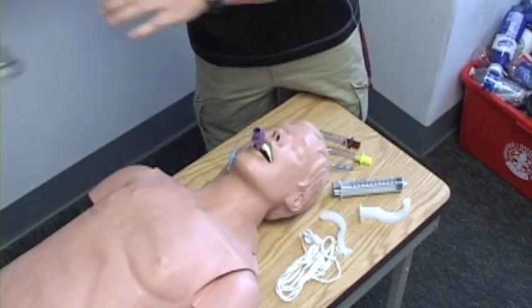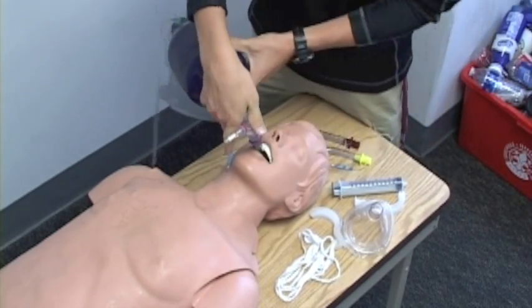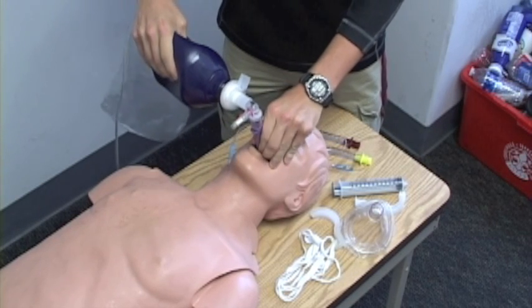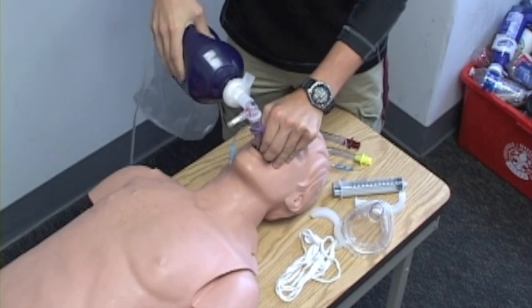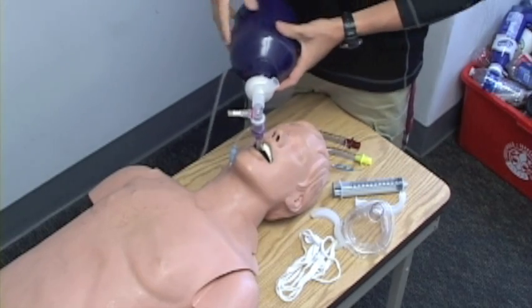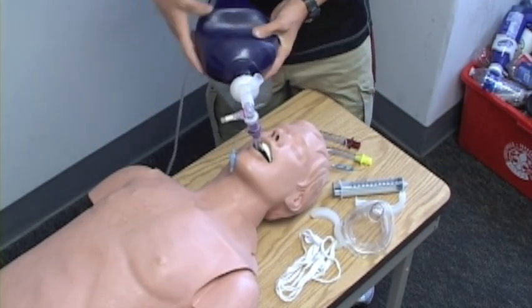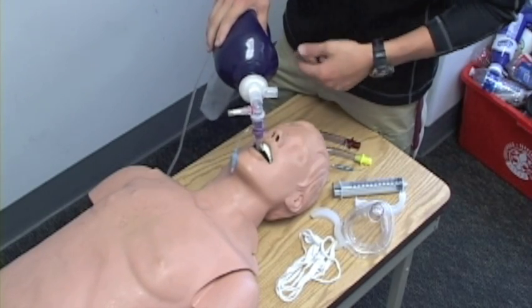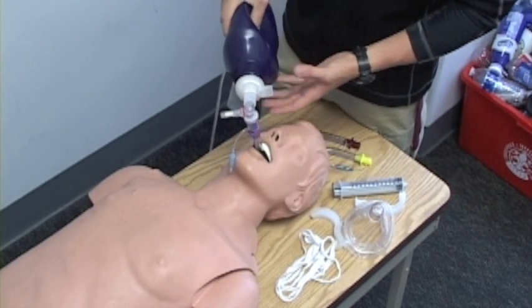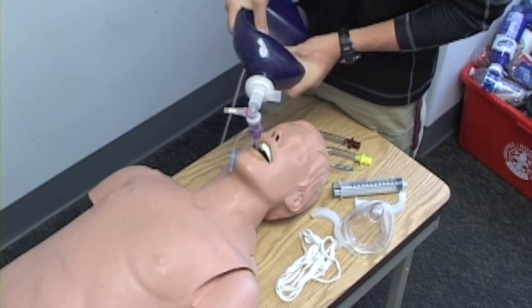I'm going to use my bag valve mask, and on the first breath, as I breathe into the patient, I'm going to raise up the King until I achieve proper rise and fall. If I achieve proper rise and fall, I'll confirm that by listening to the chest and to the gastric area to listen for any sounds there — I shouldn't hear any sounds there.